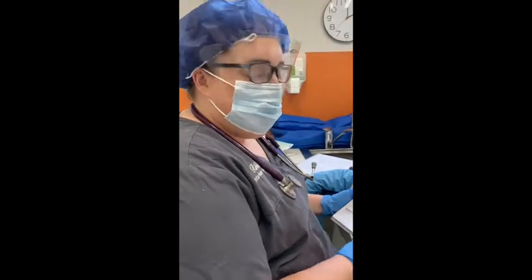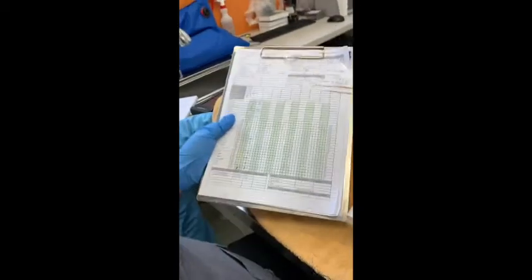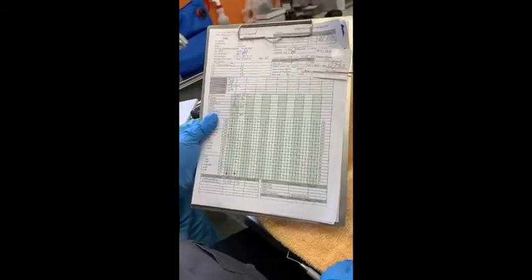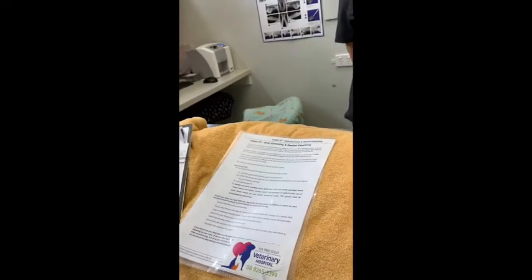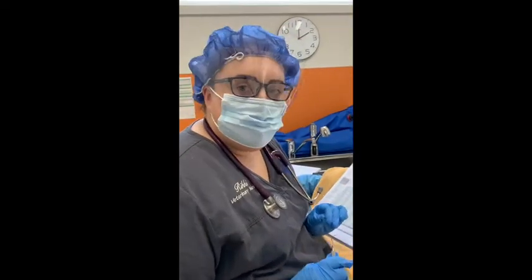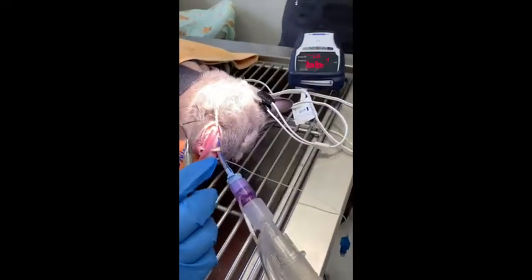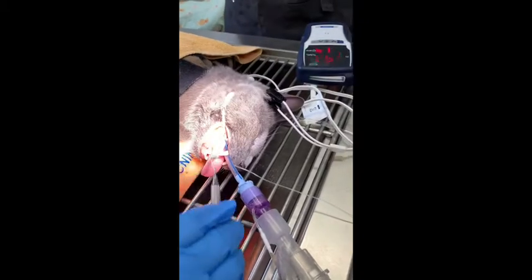So we're doing video number 37, oral anatomy and charting. This is Ziggy, who is a feline that's in today for a dental. We're going to have a look at the oral cavity, including the pocket depth and the dental pathology as well. So coming over to the teeth, we've got the maxillary, which is up the top drawer.